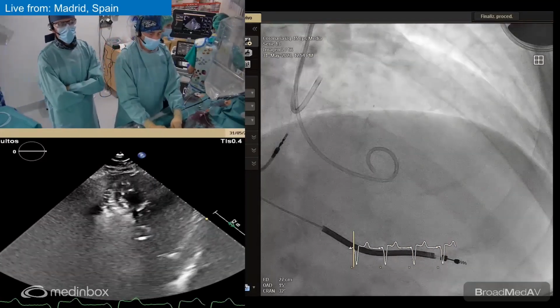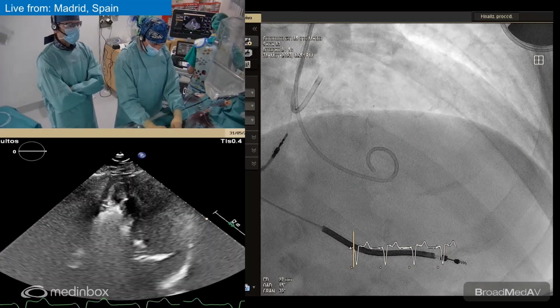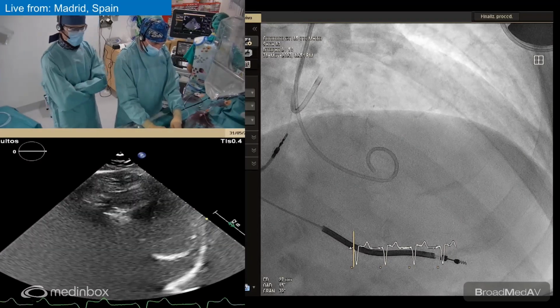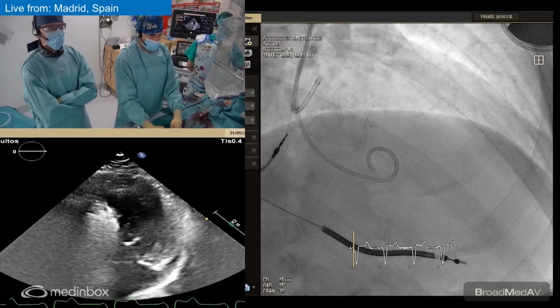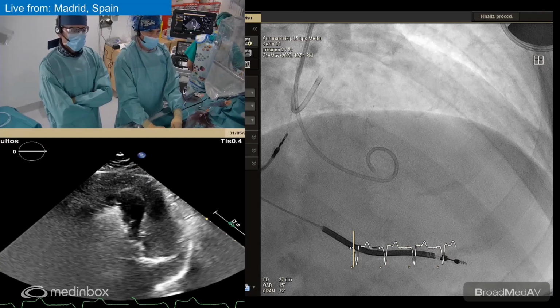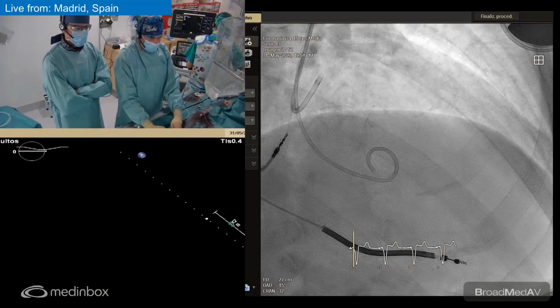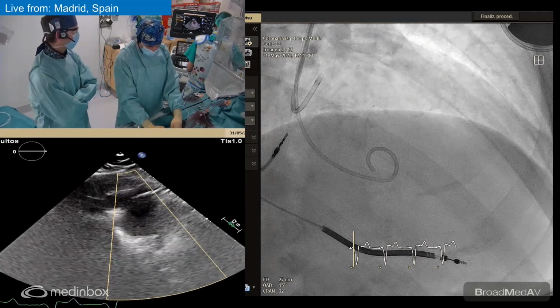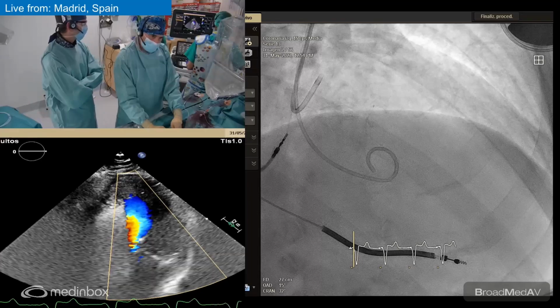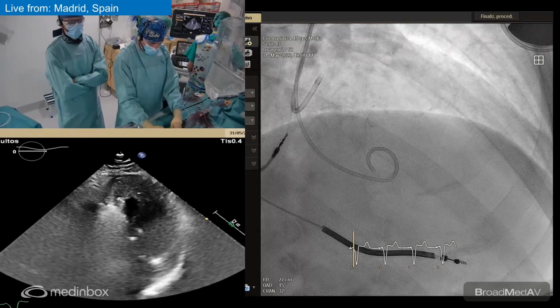Probably a good rule is to use 1 minute per cc of alcohol you administer, more or less. Silvia is doing her magic with the echo and these sepia things. And I hit the wrong button. Jellyfish mode.